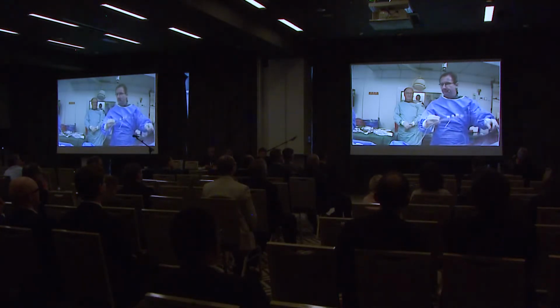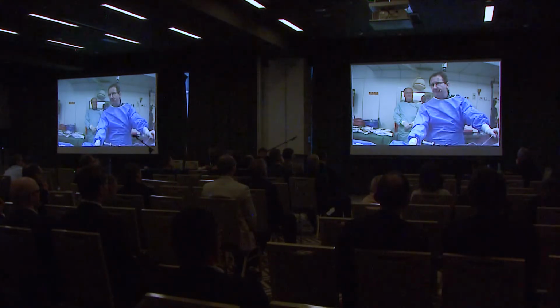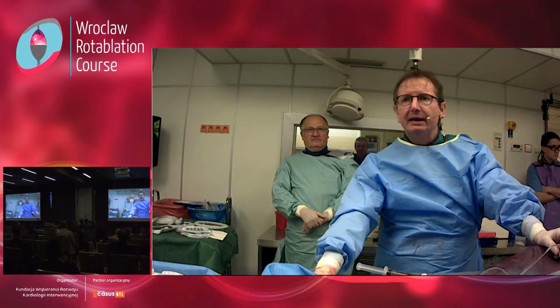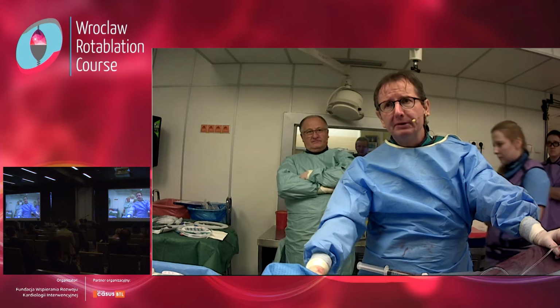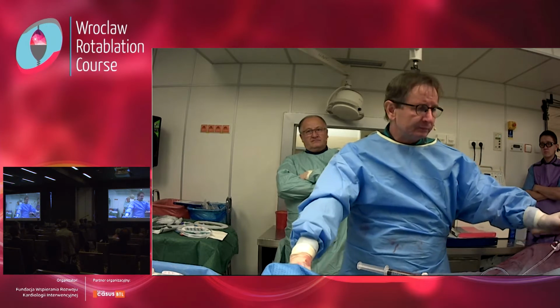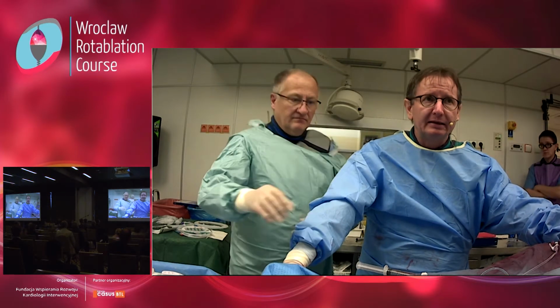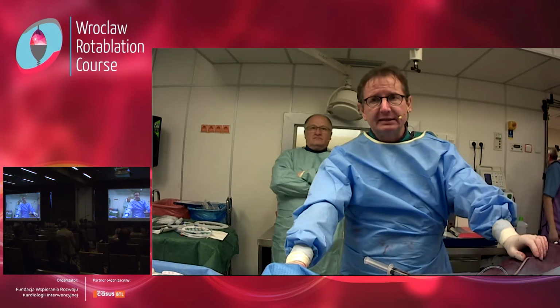Yeah, we had, after simultaneous, I would say 4 or 5 times predilatation of the ostial LAD lesion, a patient was suddenly hemodynamically unstable according to the rhythm, so he developed ventricular tachycardia, so it was necessary to perform resuscitation, defibrillation finally, and now he's intubated and at the moment at least stable.